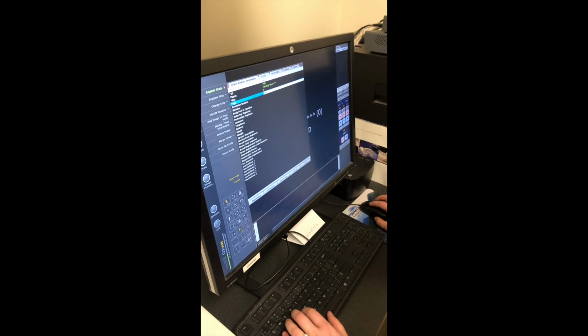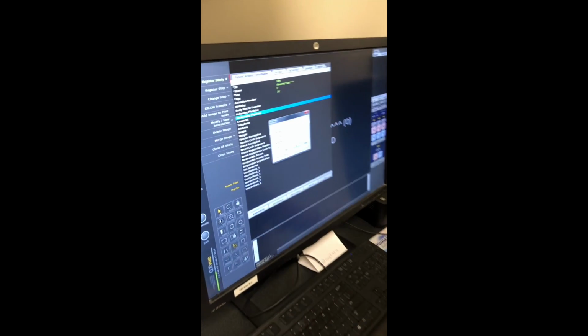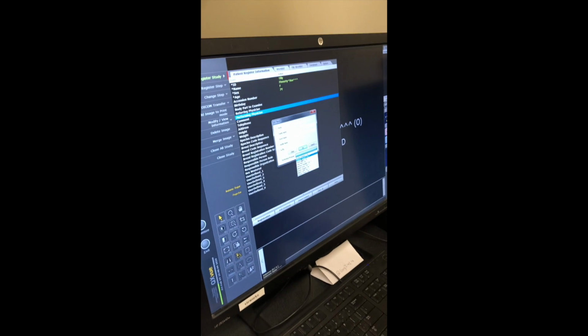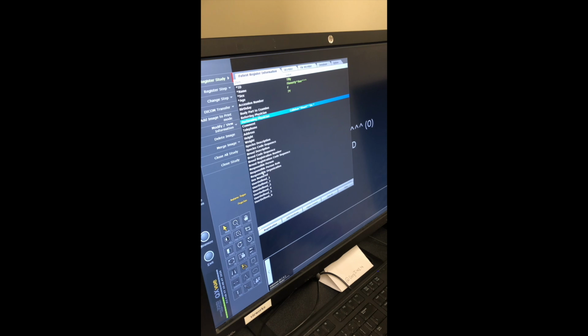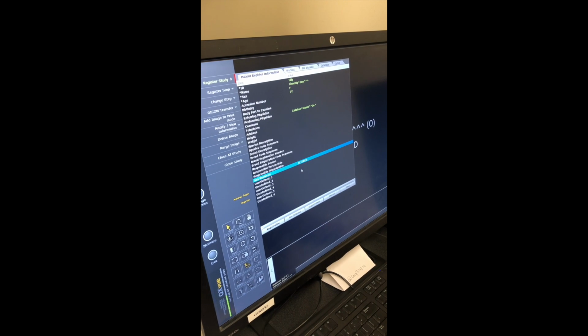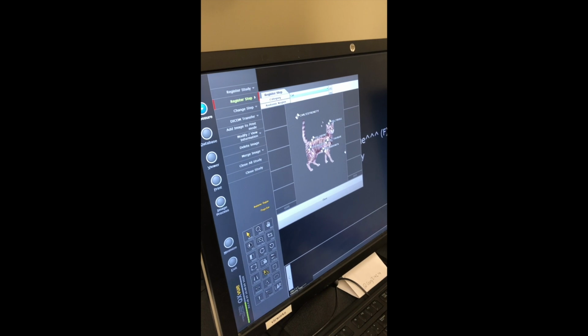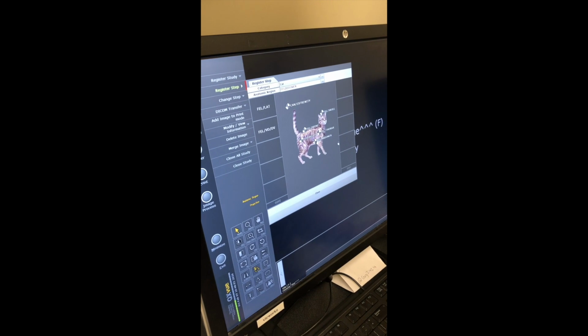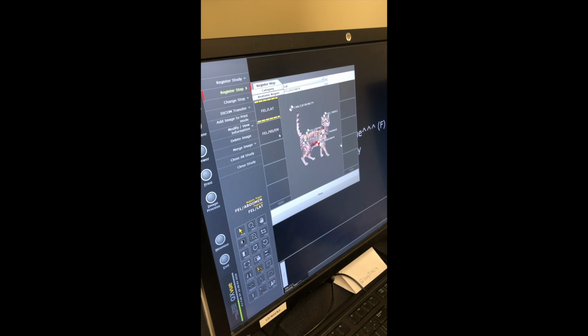Positive or negative mediums are available. Positive contrast media include barium sulfate and water-soluble organic iodides. Barium sulfate is used solely for the GI tract and can be administered orally or rectally. They are low cost and palatable, but cannot be used when bowel perforation is suspected and transit time is slow. We will be using barium in this study.